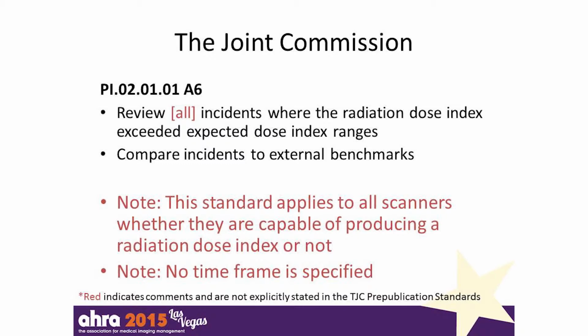One other thing I want to comment on here is this requirement does not say that it only applies to scanners capable of producing the radiation dose index. This applies to all CT scanners. So Bob Pizzatello, who's in the audience here, gave a talk earlier today where he discussed some techniques for managing that. And if any of you have an interest about that, I encourage you to ask about that during the question and answer session.